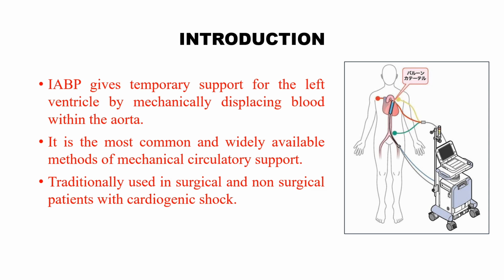What is IABP? IABP gives temporary support for the left ventricle by mechanically displacing blood within the aorta. It is the most common and widely available method of mechanical circulatory support. Traditionally, it is used in surgical and non-surgical patients who have cardiogenic shock.